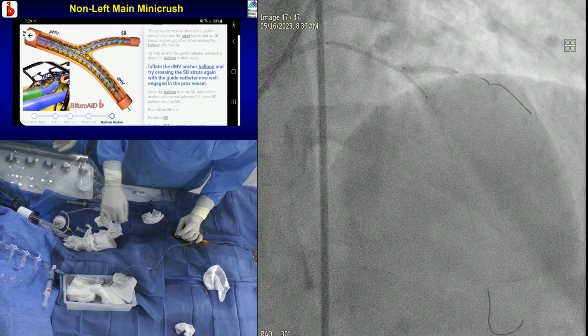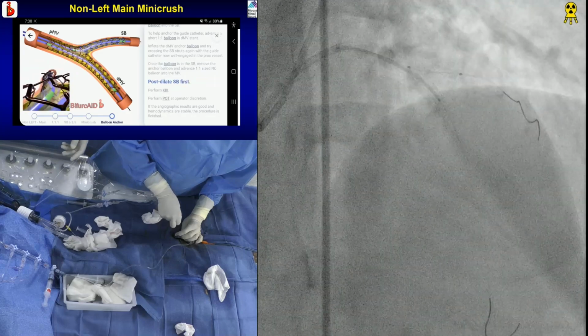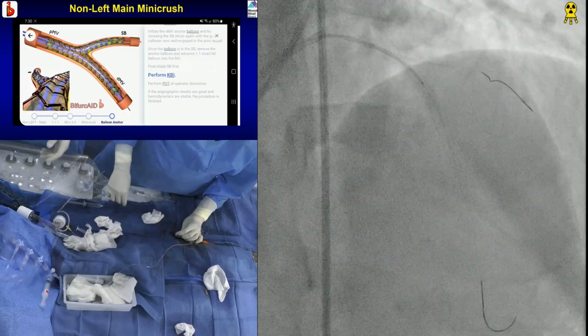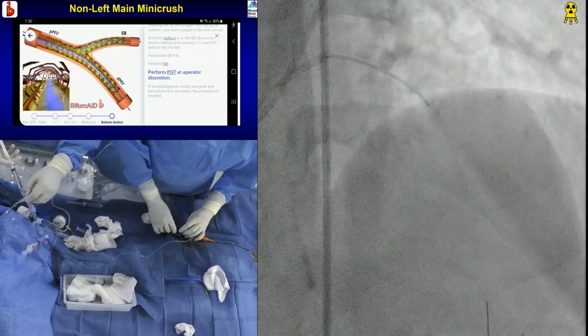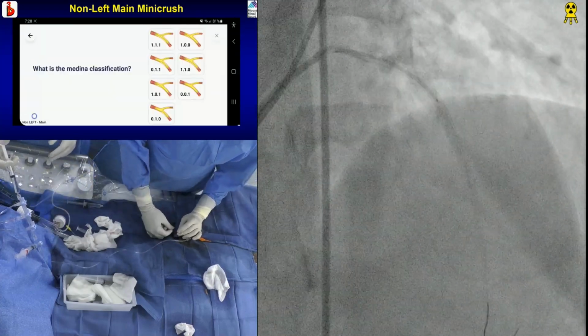Your wire is... So yes, if you had not gone with the Fielder, my second wire would have been the Whisper. Right. You want to go a little more? Too long. Yeah, that's fine. Good.